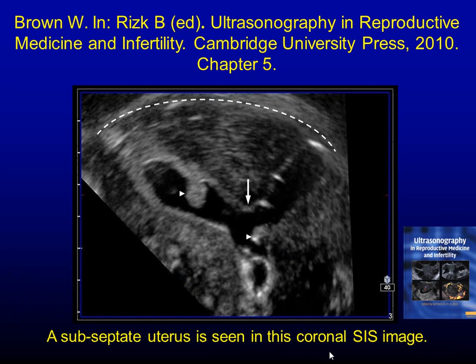This patient has double pathology. Of course, this line is computer generated to show you that the fundus was a straight line. When you look here, what does she have? She has a uterine septum. So this is a sono, this is the balloon of your catheter, a small polyp that is within normal, and then you look at one side, she also has a polyp.